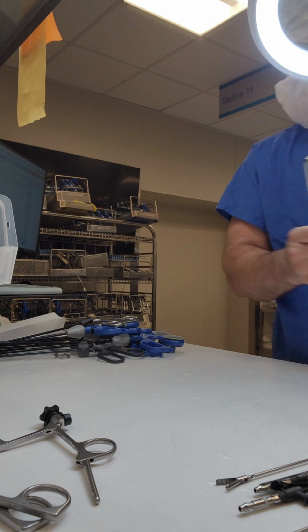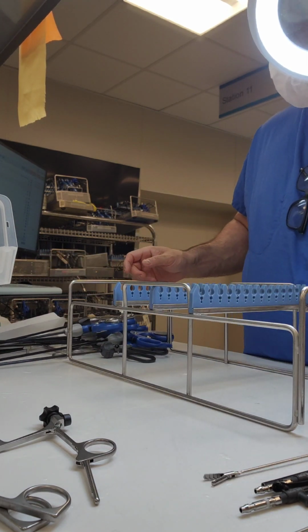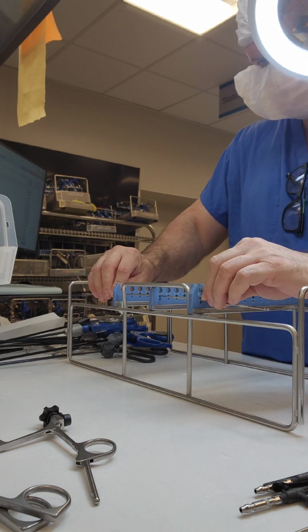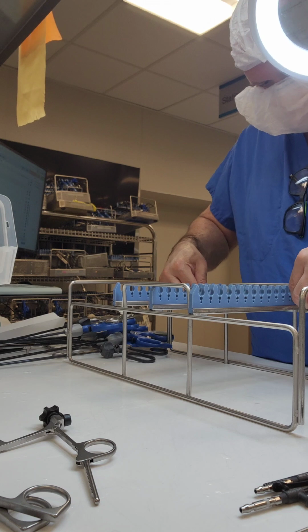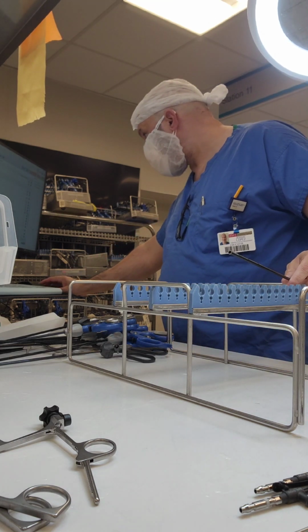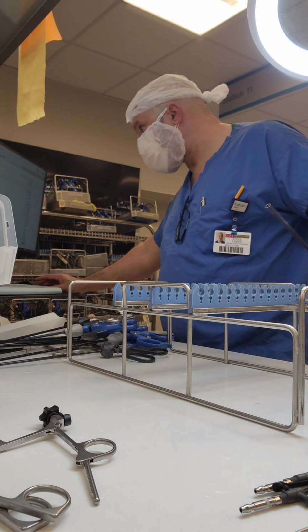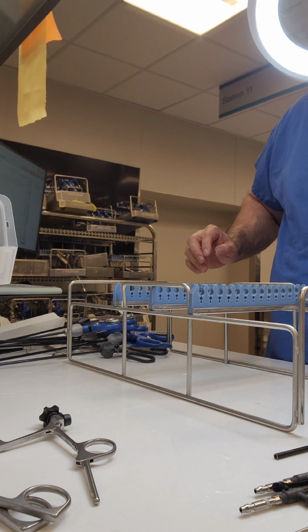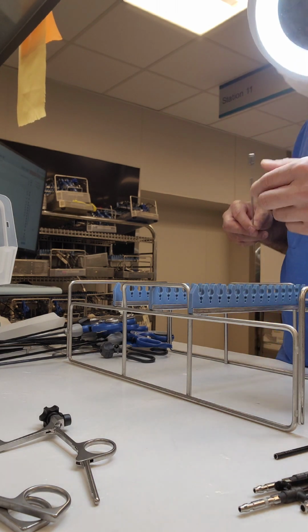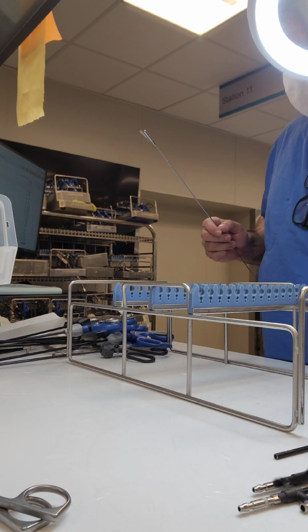Some facilities allow you to assemble your laparoscopic instruments before sending them up. For this manufacturer, I've seen the updated IFU where you can assemble the instruments prior to sterilization. It does allow that now. At one point it did not. It helps in the OR. But again, that's part of the function testing.